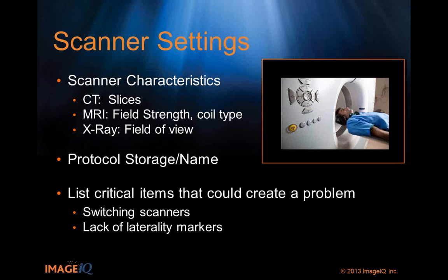Your technologist today may be used to putting laterality on X-rays with a simple click of the mouse. It drops their initials in there and the laterality. If you're anonymizing these images for your study and stripping the PHI off of them, it may strip that digital overlay off as well, and then you've got images with no laterality markers. Or it may not. You need to know, and you need to declare it.